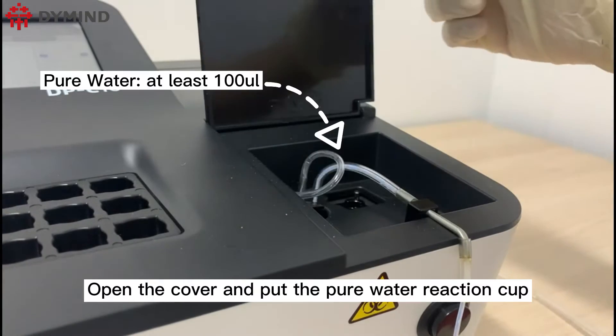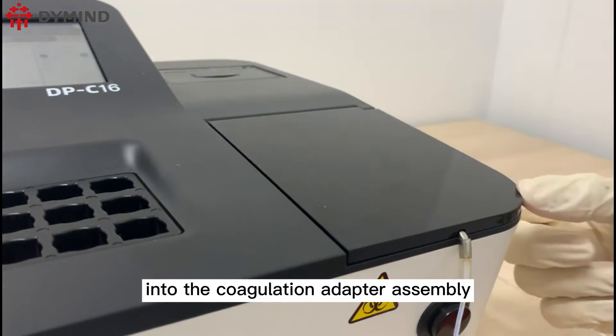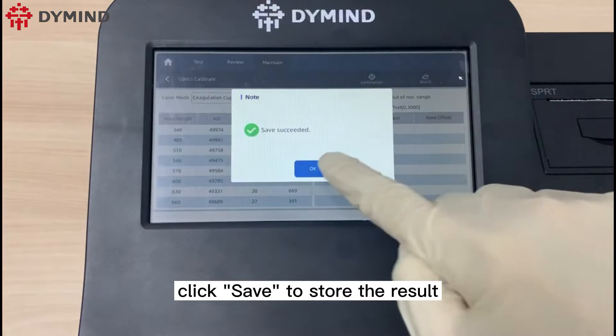Open the cover and put the pure water reaction cup into the coagulation adapter assembly, then click start and wait a moment. After finished, click save to store the result.